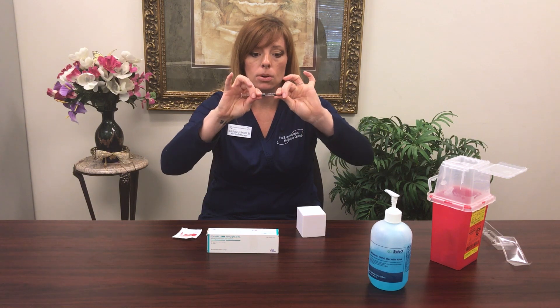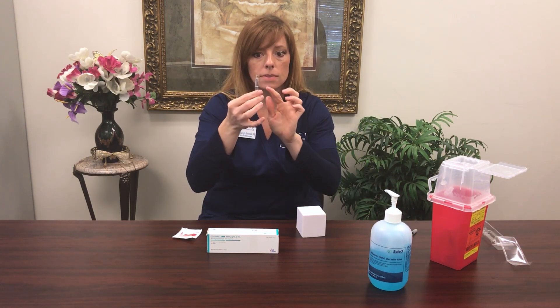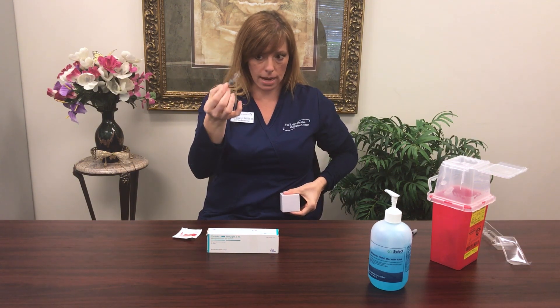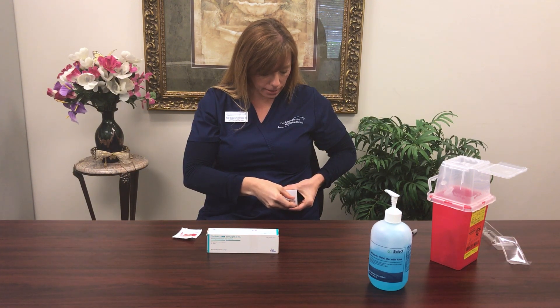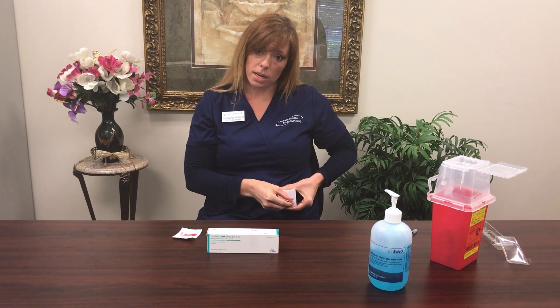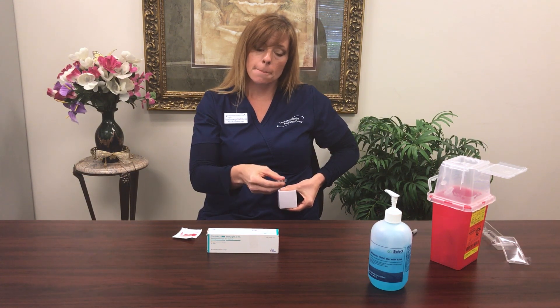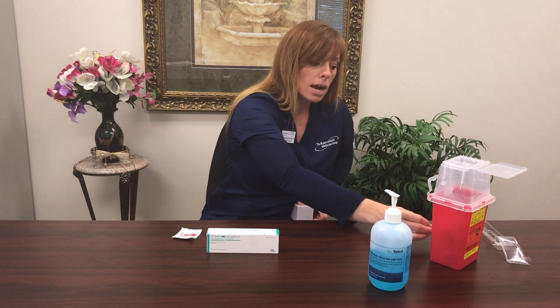Next, pull off the gray cap from your Ovidrel. Remember, please don't remove the air bubble. Take your Ovidrel syringe, go at a 90-degree angle straight into your belly, and push all of the liquid and the air into your skin. When that plunger is completely flush with the end of the syringe, pull out your needle. Then find your local sharps box, drop your syringe into it, and you're done.